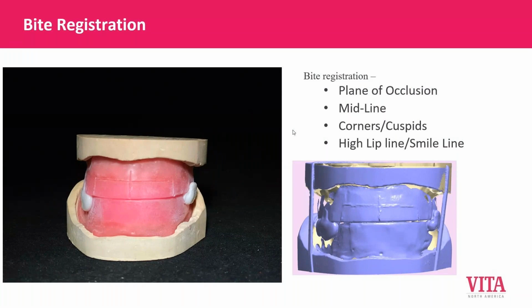It should be the responsibility of the clinician who is taking the records to determine which teeth should be used in this denture, that they should go through it with the patient and all that other kind of stuff. Does that happen all the time in the real world? Not so much, and that's why I get that question a lot, because the denture cases get sent to the laboratory, and it comes down to the technician who's responsible for picking the teeth.